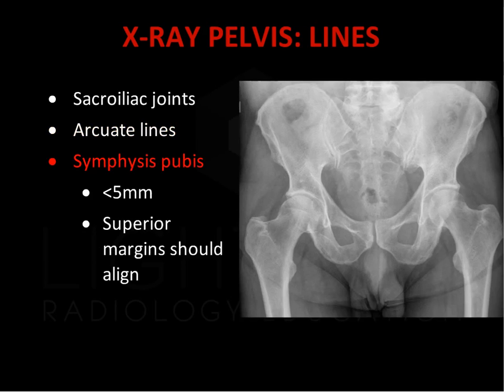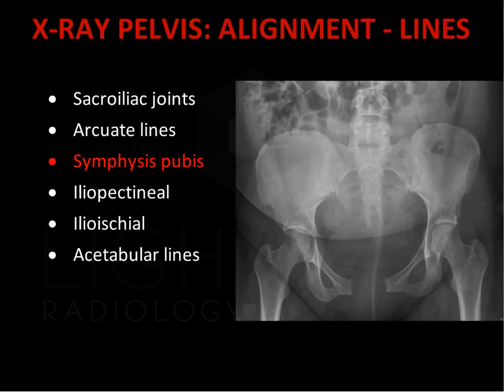The pubic symphysis should be less than 5 mm in width, and the superior margins of the pubic symphysis should align. Ligamentous disruption of the pubic symphysis can occur in trauma, resulting in diastasis with widening. This is a case of an open book pelvis, where there is purely ligamentous disruption of the main pelvic ring involving both the sacroiliac joints and pubic symphysis.